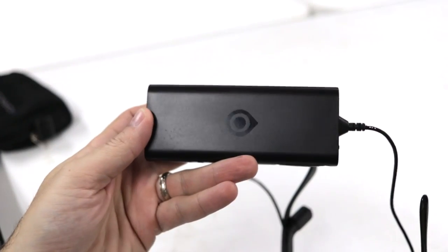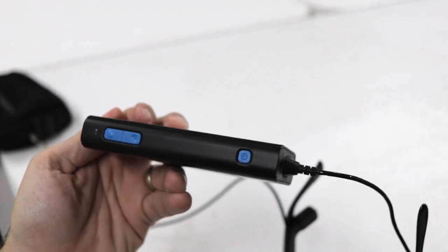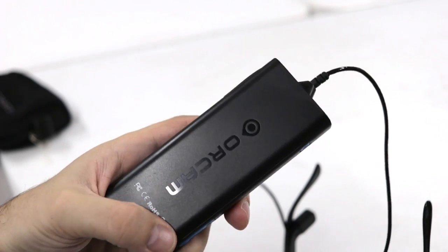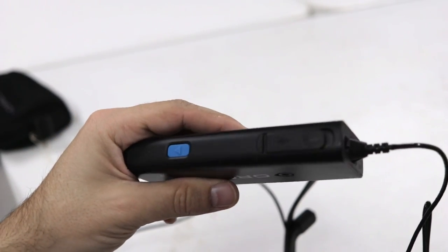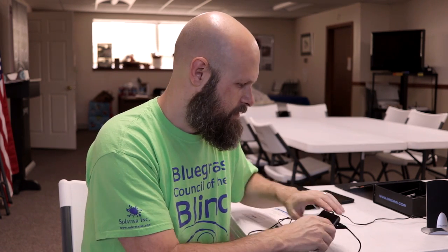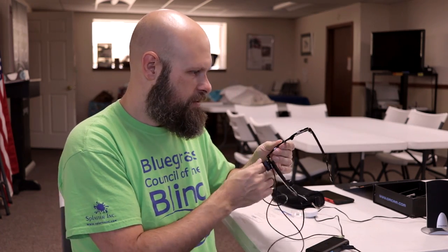The controller has a couple of buttons to note: there's a volume up and down button on one side, the take picture button on the other, a little port for power, a headphone jack on the back side, and a power button on one side as well. The device will put itself to sleep after a few minutes of not being used, and then it will also auto shut down after a few minutes after that.